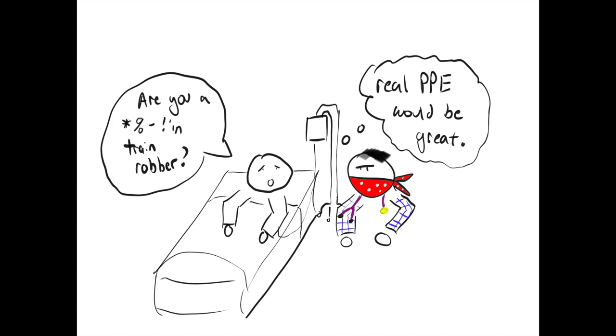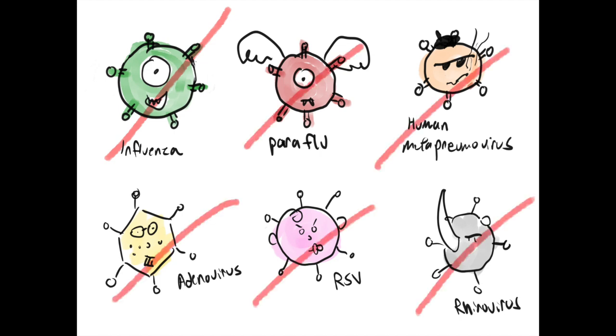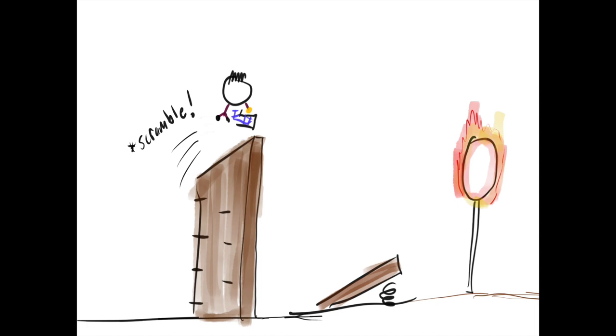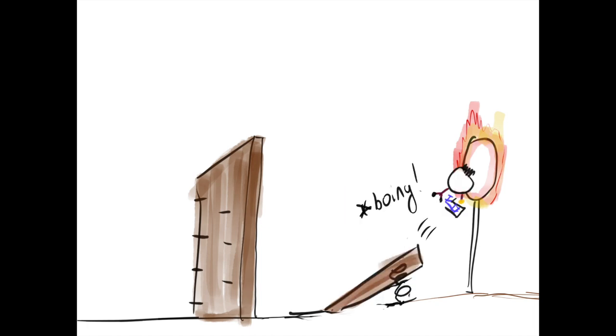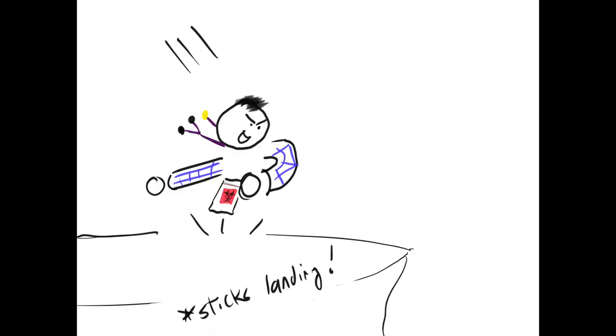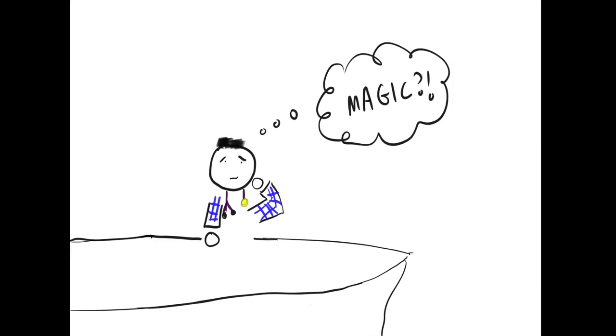So you're caring for a patient with flu-like illness. You've ruled out other viral pneumonias, this in spite of knowing the high co-infection rates. You've been on hold with infection control for 40 minutes, gotten your angry and frightened patient to agree to their third swab attempt of the day, stuck it all in the plastic baggie in the scariest biohazard fridge in the hospital, and you send the sample to your lab. And now what?